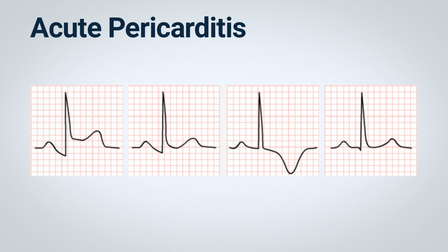In certain patients, pericarditis episodes may recur or relapse, either intermittently or over sustained periods. The corresponding ECG findings can vary greatly, sometimes reflecting the characteristics of acute or evolving pericarditis. The presence of pericardial effusion may lead to low voltage, which will be further discussed.